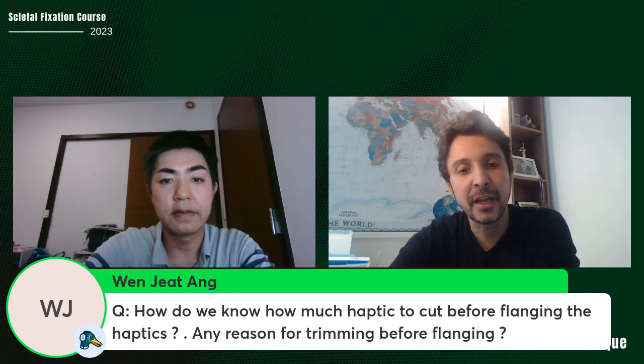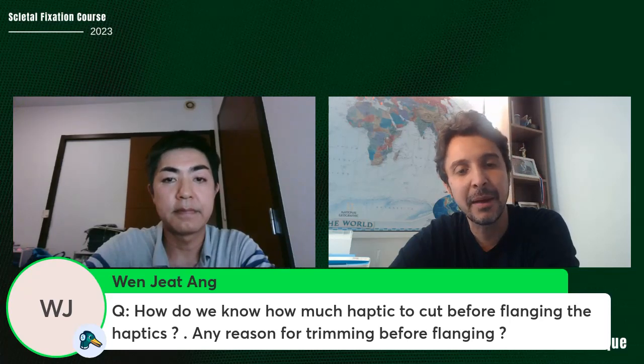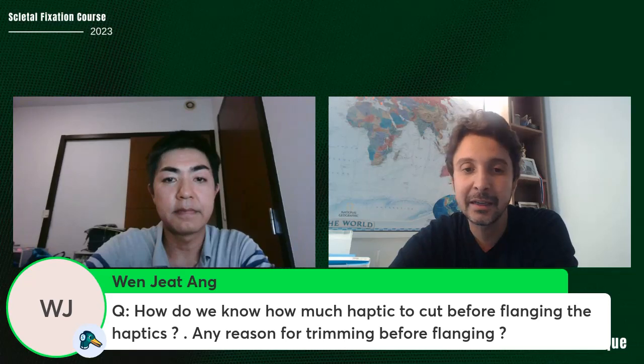I personally suggest the Sensar AR40. I think it is the best way, the J&J Sensar. I think it is the best IOL for your technique outside of Japan. I always say to my fellows and colleagues, please never use Alcon MA60 type 7B, it is not good for your technique. Outside of Japan, the Sensar AR40 I think is the best. I don't know if you agree with this.